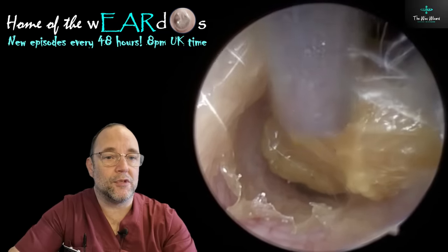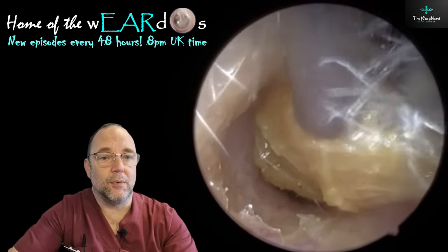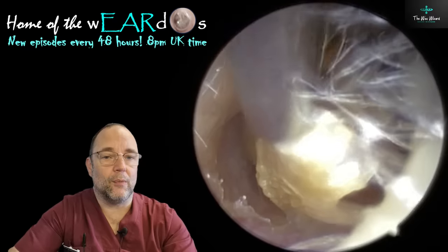It wasn't a huge amount in there, but it was enough to block up a very small ear, which is certainly what she had. But it was quite loose, thankfully, this skin. She'd oiled it quite well, thankfully.